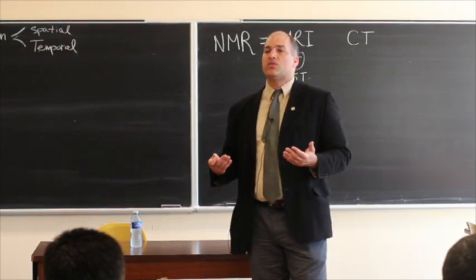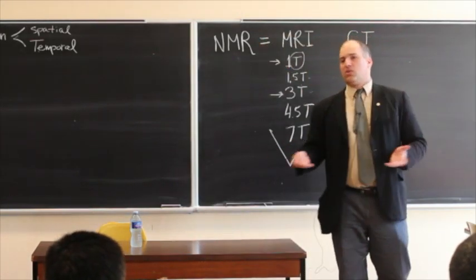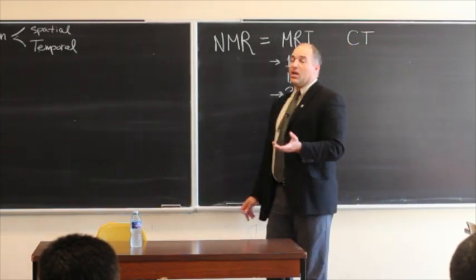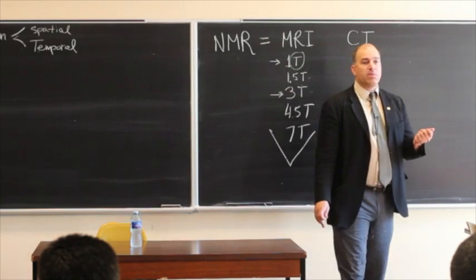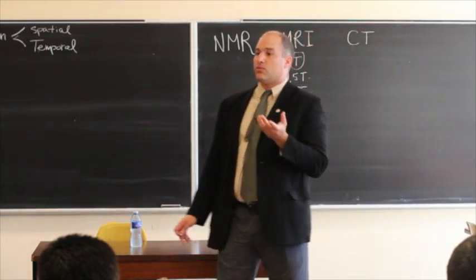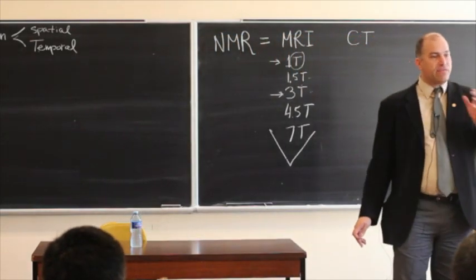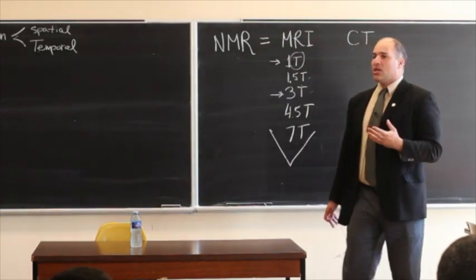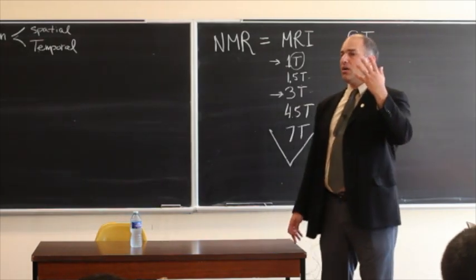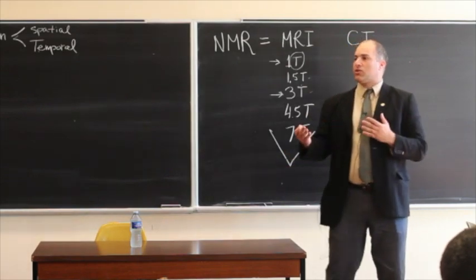My brain felt as moist to me today as it did 20 years ago. But it turns out that as you get older, your brain dries up. You lose liquid. MRIs are very sensitive to the amount of water you have in your brain, which has to do with hydrogen atoms and so on. Because of all these things, imaging of brains that are drier is very different from imaging of brains that are more water heavy. And that creates a completely different picture regardless of anything else.